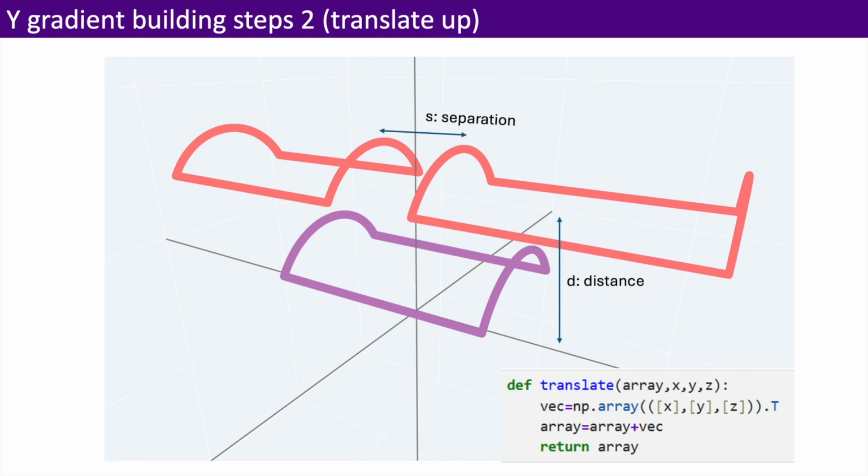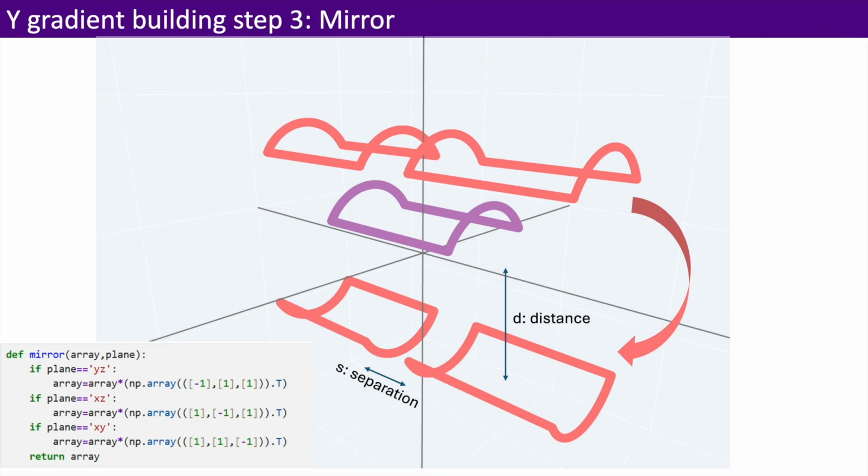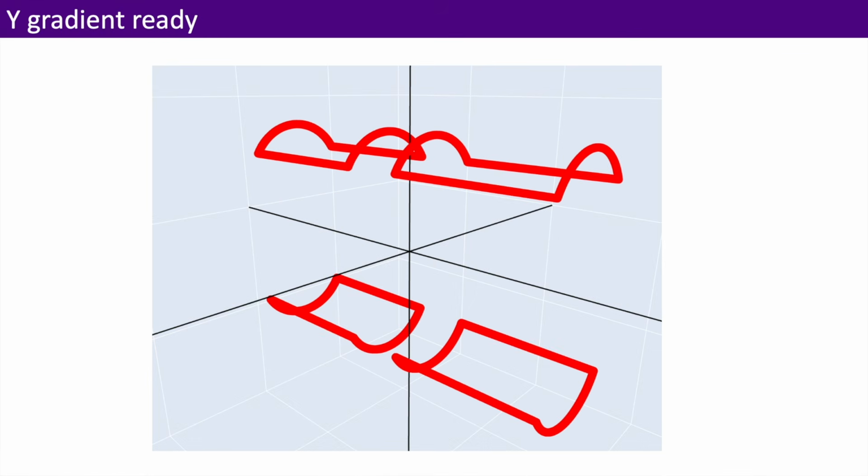So here we already got 2 coils, and in order to get the remaining 2 coils we need a mirror function. So what does the mirror function do? It takes the array, which is again the array of the coordinates of the coils which we want to mirror, and it takes the input plane, so on which plane we want to mirror the coordinates. The plane can be yz, xz, or xy, and mirroring is defined from linear algebra. As you can see, we just multiply by a corresponding vector and return the array. And after the mirroring, now we have the Y gradient ready.